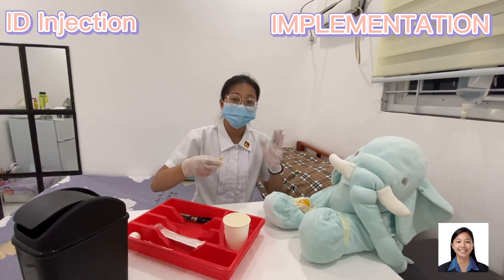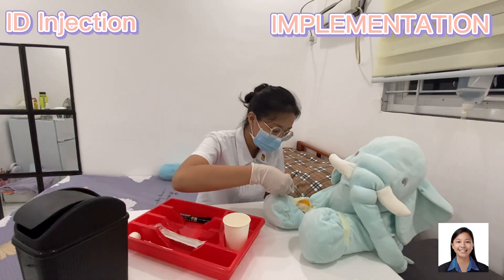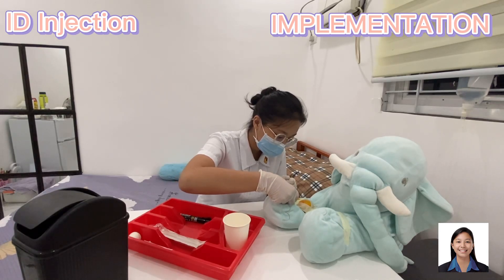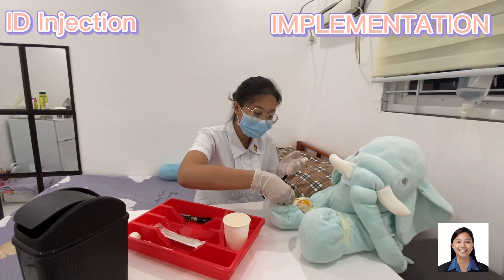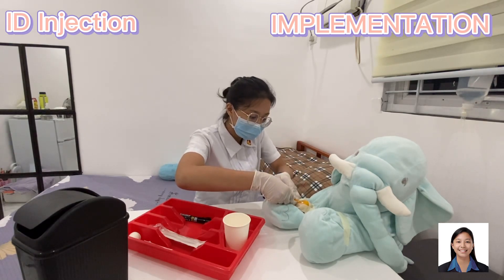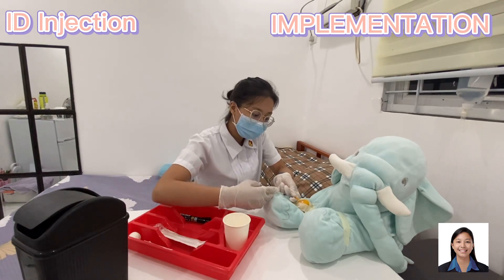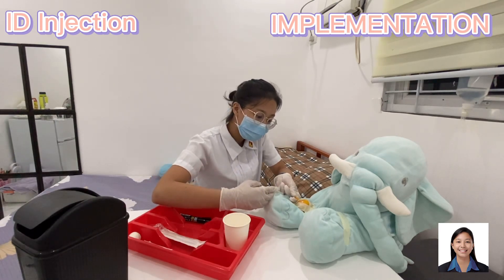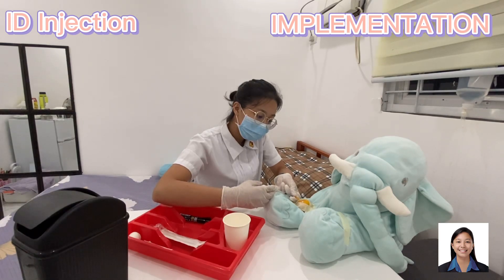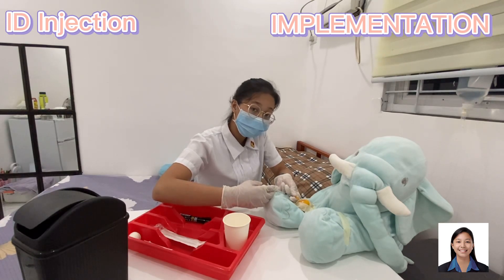Inject at a five to fifteen degree angle. Then steady the hub with your non-dominant hand. Inject slowly and steadily. While injecting, you can notice a small bleb forming.